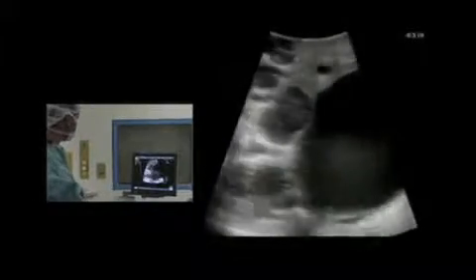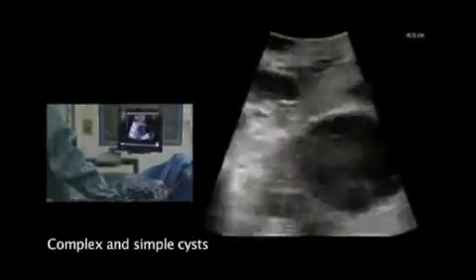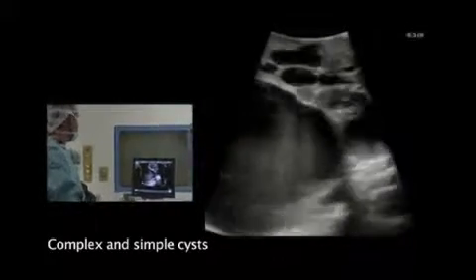Then we will move away from here. That is in the left liver lobe. We go to the right liver lobe and all the way upwards as far as the dissection allows us. And then we can see the cystic structures out here become more complex, whereas it is a little more simple cystic appearance here.